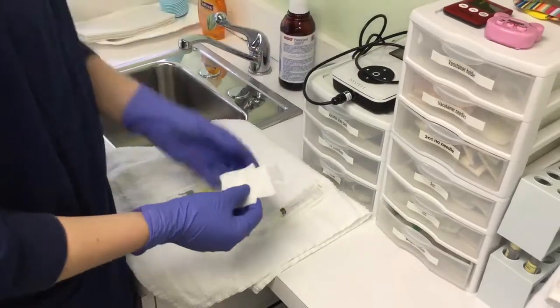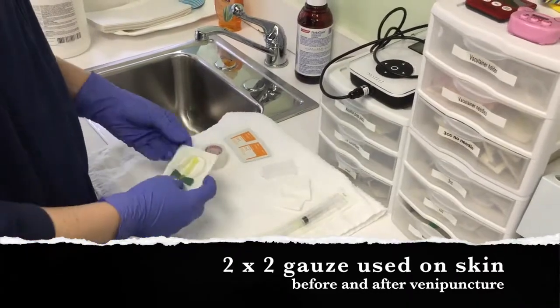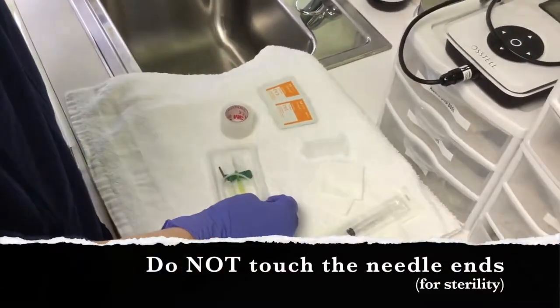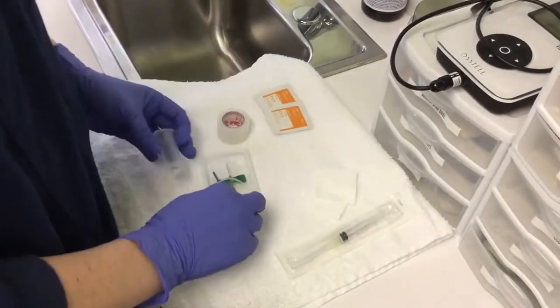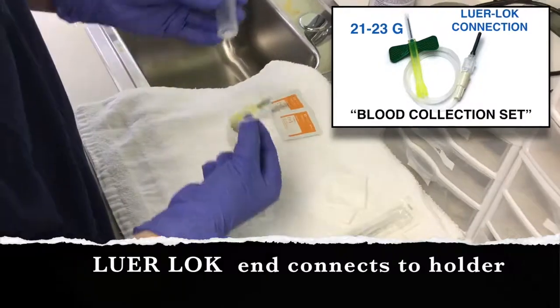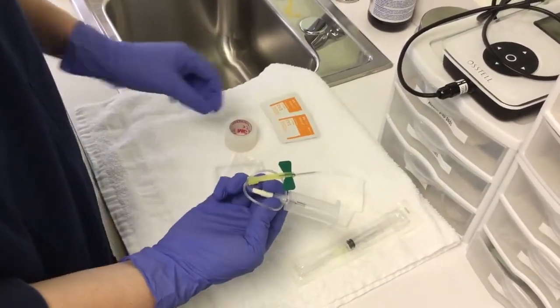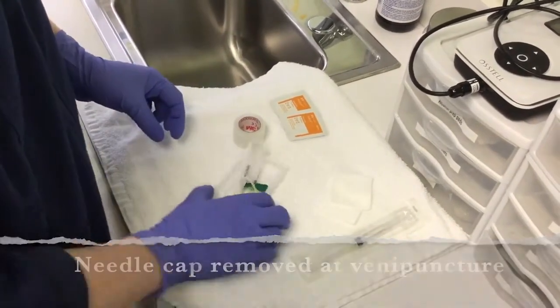We will need three pieces of 2x2 gauze. To set this up, you open the vacu-tainer needle without touching the needle itself. You grab the vacu-tainer holder and, without touching anything, place the gray piece and twist it until it's tight. Leave the cap on the needle — Dr. Kim will remove that himself and lay it back on the tray.